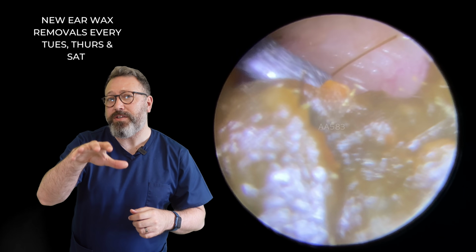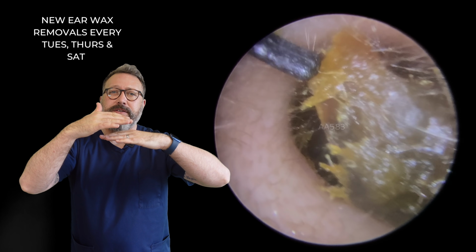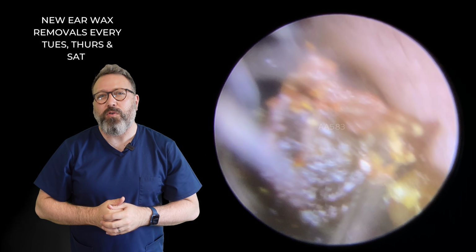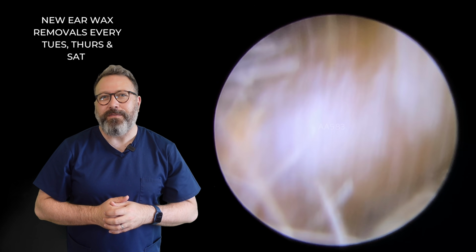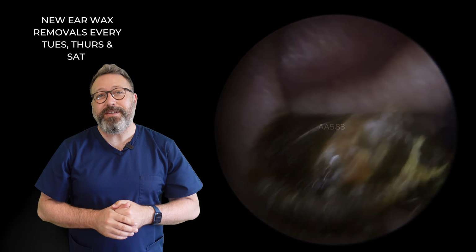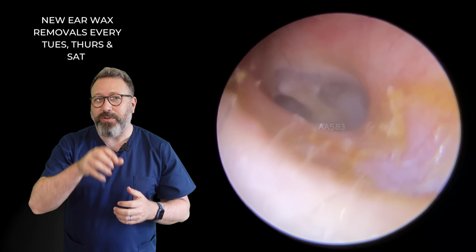Now this is perfect for the St. Bart's hook because you've got this quite big gap above the top of the wax, so it allows us to accommodate that tool really easily, and then we can roll this like a little boulder down the ear canal. There we go. Very kind of Indiana Jones-esque as it's coming down the ear canal there. But there we are, we can see that plug of wax. You'll see a little tail of dry skin. There we are, that's what was holding this in place.